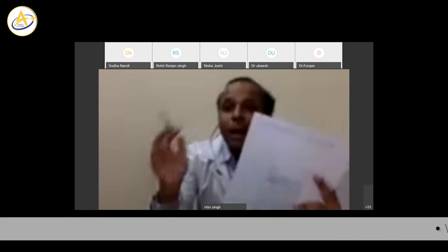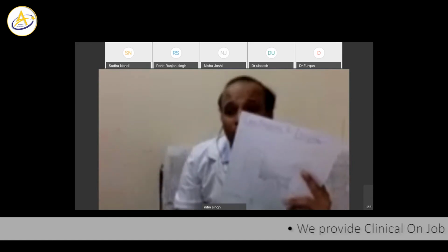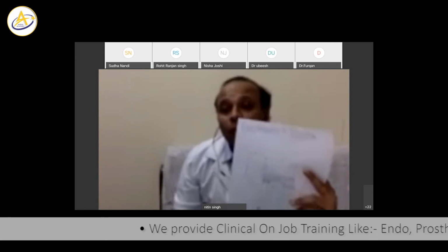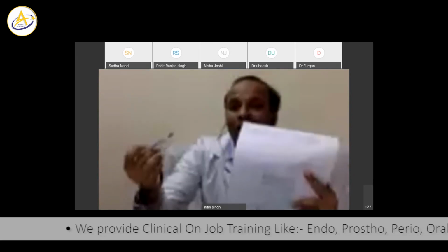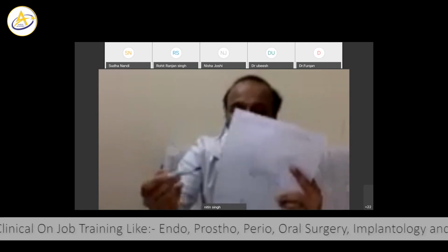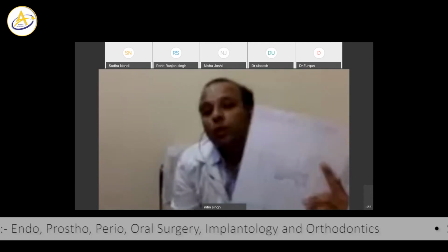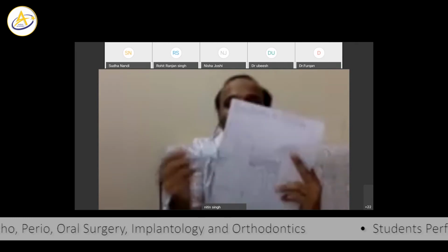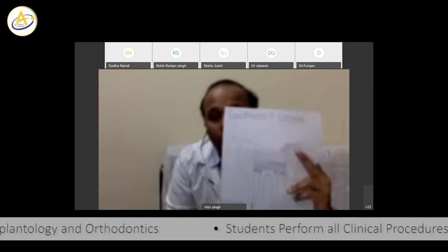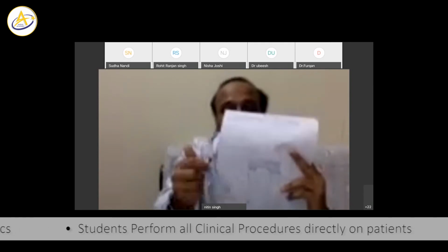It may be found in healthy as well as carious teeth, which require filling or may require endodontic treatment. When the tooth is going for endodontic treatment, that is root canal treatment, if you encounter a pulp stone, you will be able to see it in your radiograph as a calcified mass. While performing endodontic treatment in these kinds of teeth, you need to remove this stone.